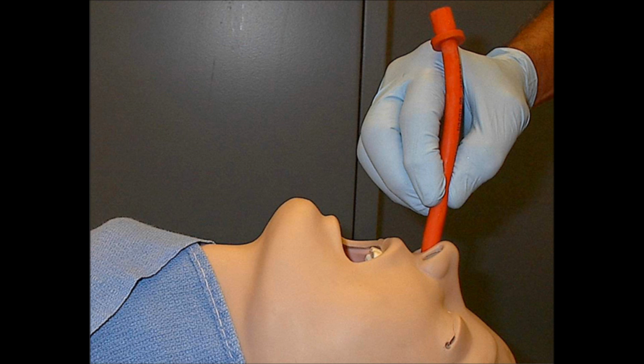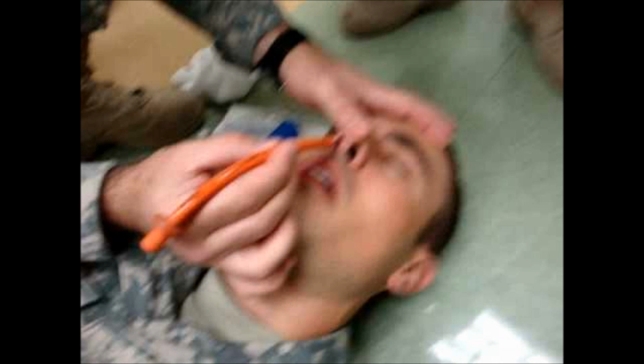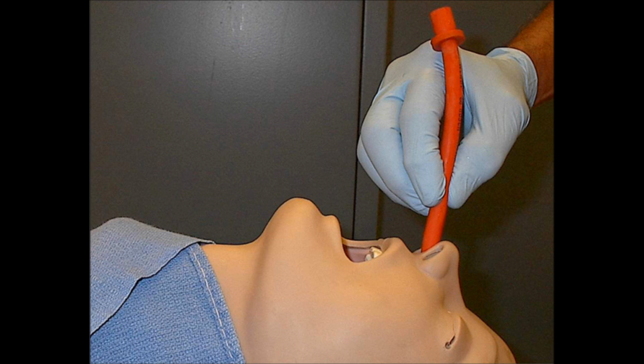What you are going to do is pass it gently along the floor of the nasopharynx. If you encounter resistance, you have to slightly rotate the tube to facilitate insertion at the angle of the nasal passage and nasopharynx. Attempt placement through the other nostril, because patients have different size nasal passages. As much as possible, insert it softly, not forcibly, because the airway can irritate the mucosa or lacerate adenoidal tissue and cause bleeding with possible aspiration of clots in the trachea.